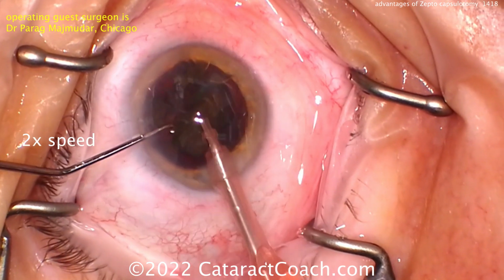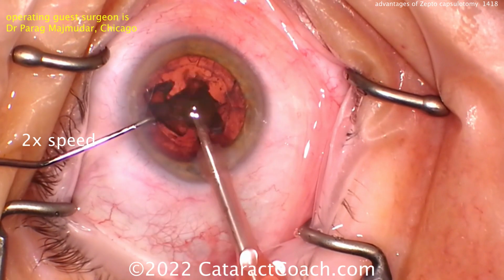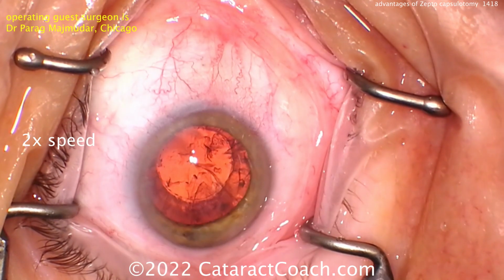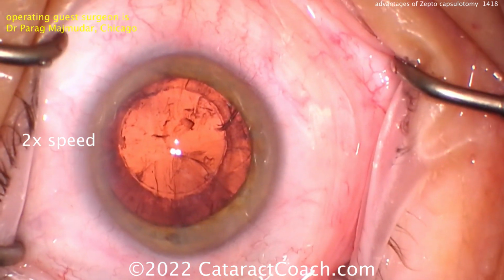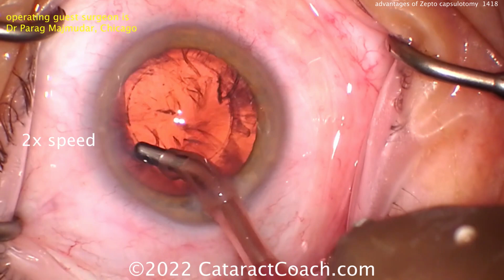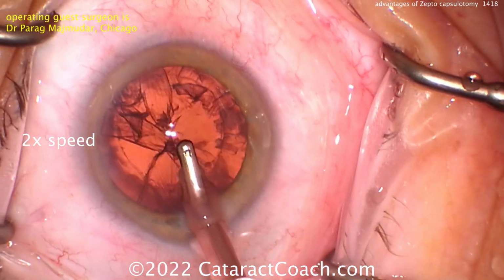So if you have a case where you have a challenge like an intumescent white cataract, or even a routine case like this that's going to get a premium presbyopic EDOF IOL, you may want to ensure that great rhexis or that great capsulotomy centration, and you can do that by using this device. So again, I like to show you just various options, things you can use. Here you can see the nucleus is nicely removed. Now just kind of cleaning up the cortex, and the rest of the case will proceed normally.